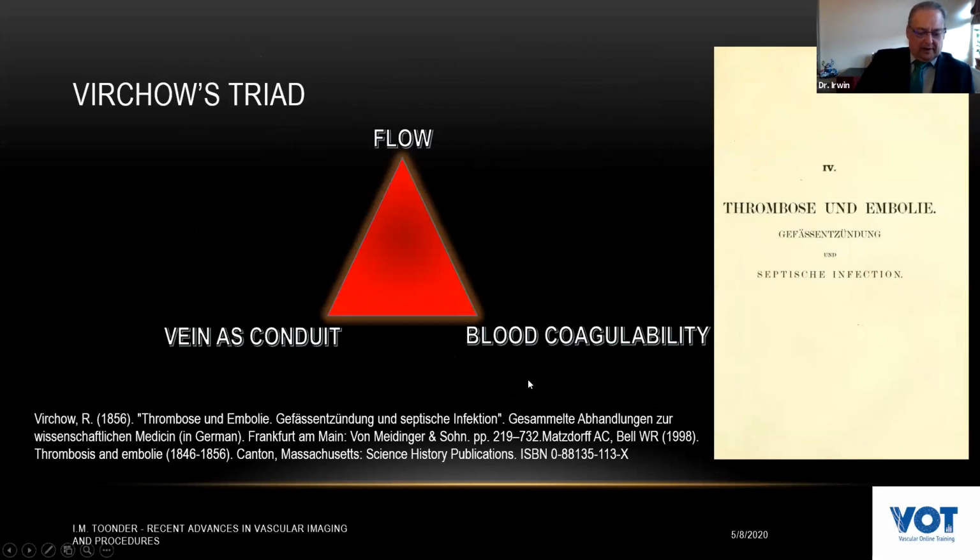And if you're talking about May-Thurner, we see a lot of publications talk about the virtues of stenting, and we should consider what we are really looking at. We're looking at the flow, and this is what we can do with duplex, looking at the vein as a conduit. The nice thing about duplex is that you don't just do it in a supine position. Contrary to all the other imaging modalities, we can put the patient upright, and we should do this.